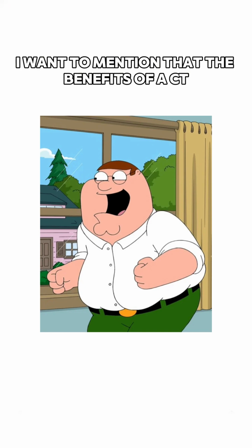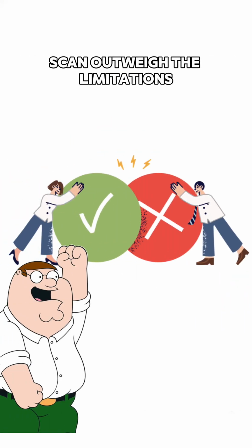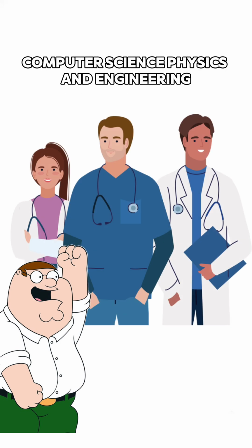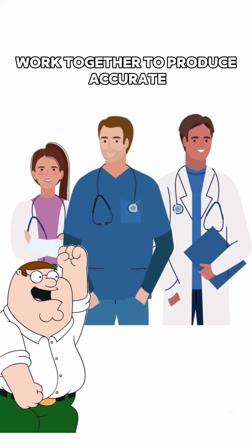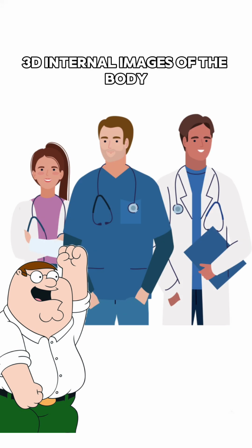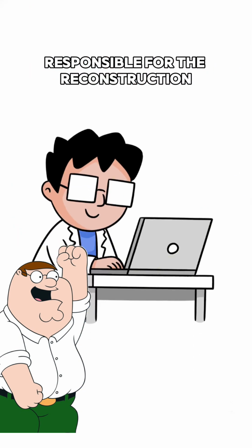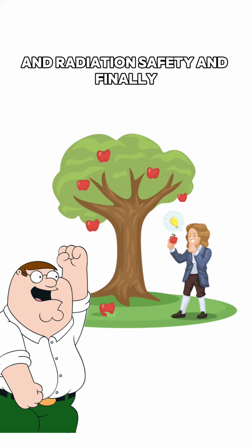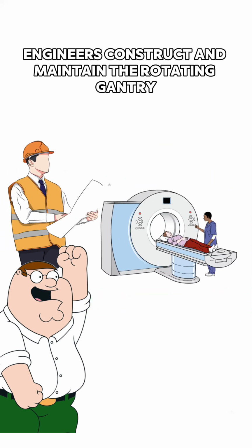Well, Stewie, before I get into it, I want to mention that the benefits of a CT scan outweigh the limitations. The ongoing communication and collaboration of three highly technological fields, computer science, physics, and engineering, work together to produce accurate 3D internal images of the body. Computer scientists are responsible for the reconstruction algorithms that produce the images, physicists apply their knowledge of photon interactions and radiation safety, and finally, engineers construct and maintain the rotating gantry.